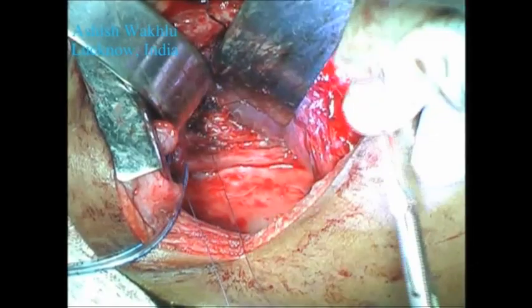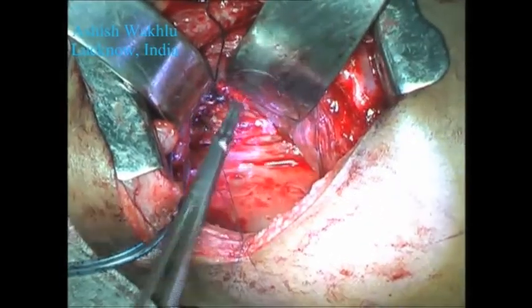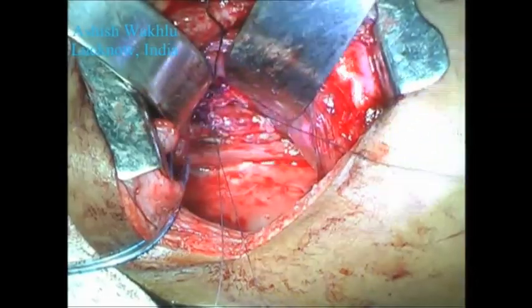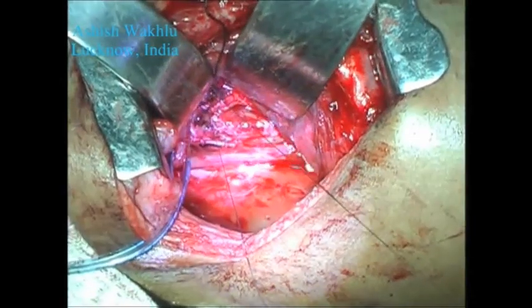With a bit of luck, at the end of this effort we expect to see the right lung inflating with the compression of the airbag by the anesthesiologists.